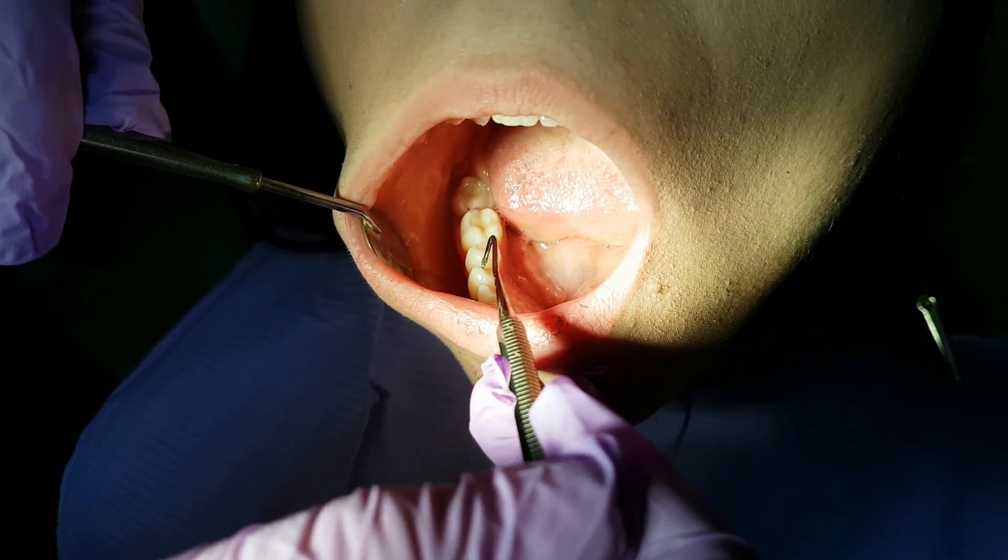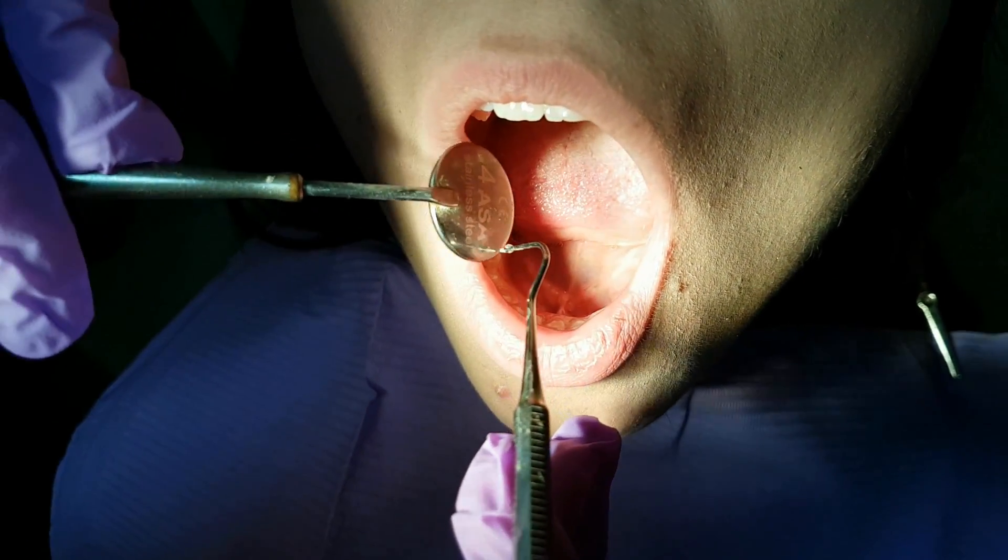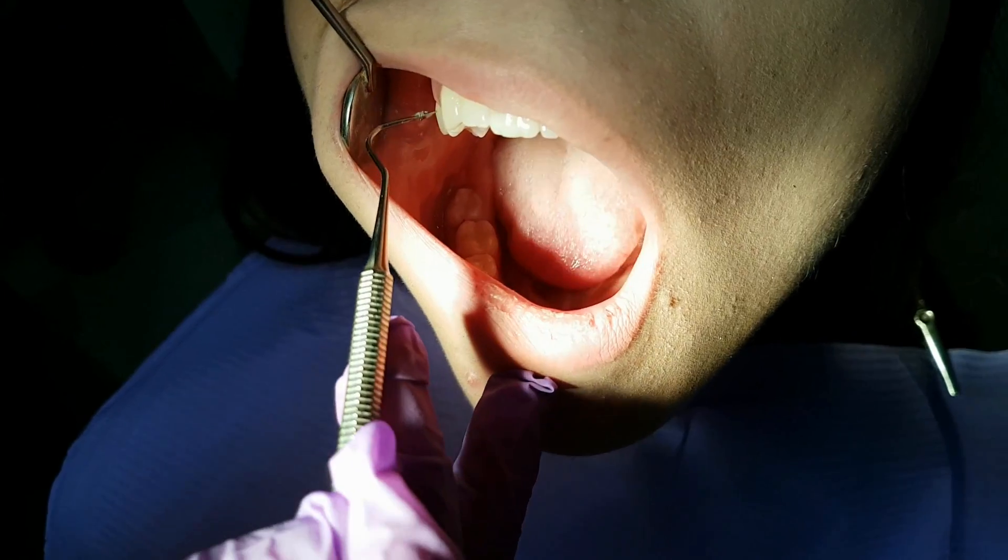These two instruments are the basic diagnostical instruments in everyday dentist use.